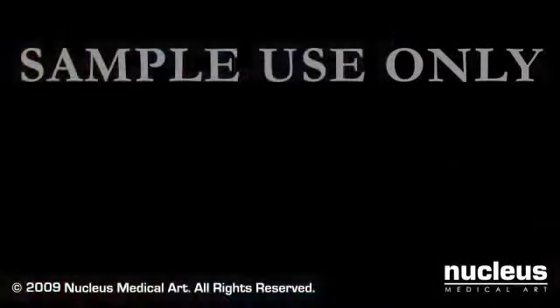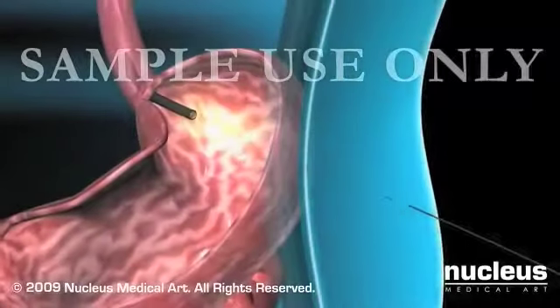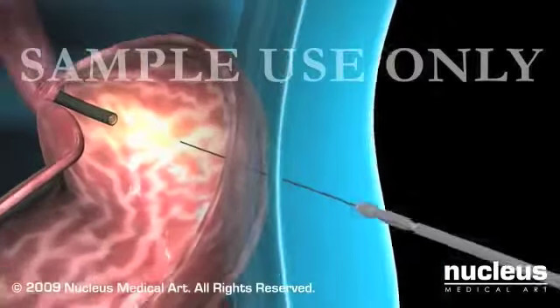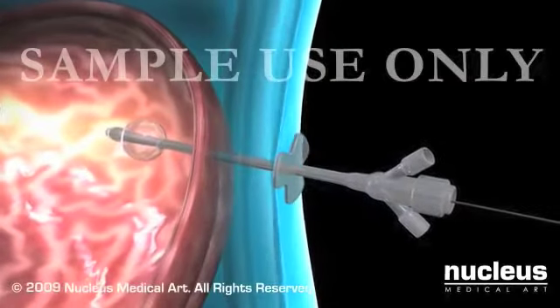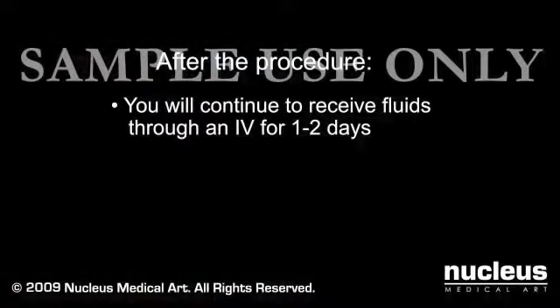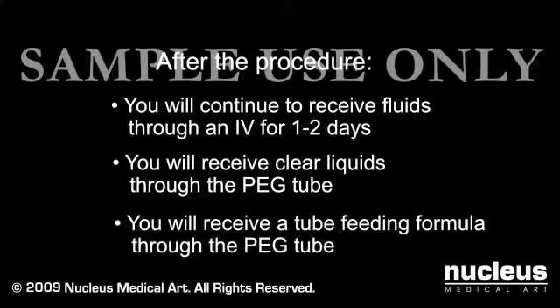In the alternative push method, your doctor will begin in the same fashion by using an endoscope to guide a wire through your abdominal wall and into your stomach. But instead of pulling the PEG tube through your mouth, he or she will push it directly into your stomach over the wire. After your procedure, you will continue to receive fluids through an IV for 1 to 2 days. Once there is evidence that your digestive tract is functioning, you will receive clear liquids through the PEG tube. If clear liquids are tolerated, you will receive a tube feeding formula through the PEG tube.